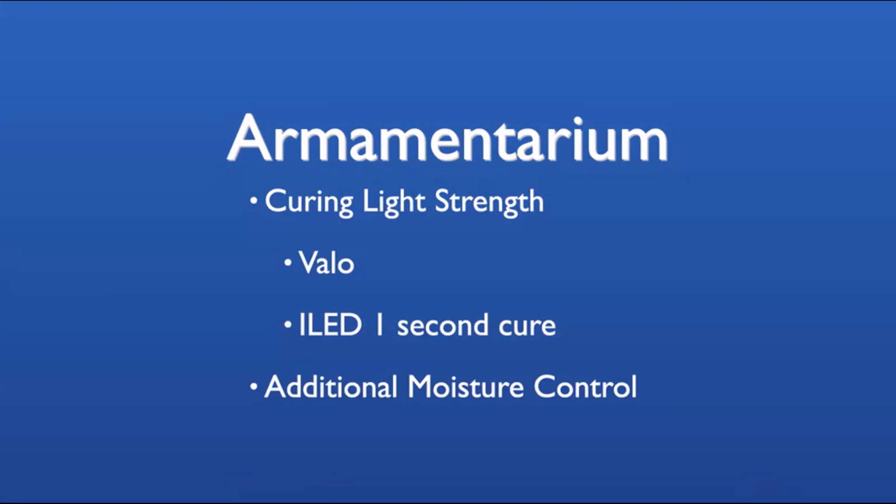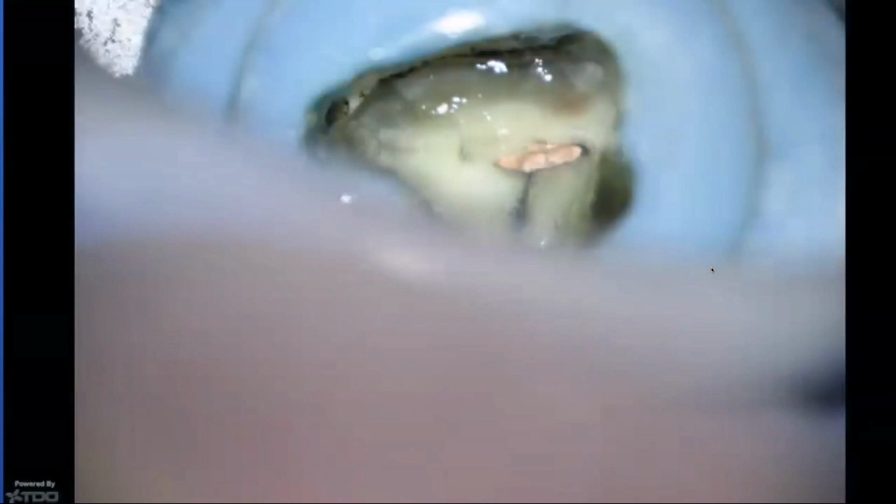In terms of additional moisture control, using something like, not opal dam, in order to seal around the rubber dam clamp, any material like Cavit that's more so hydrophilic, uh, Oraseal, Mark, or caulking. Exactly, what did you say? Oraseal? Oraseal, that's it. Thank you, thanks, Matt, I appreciate it. Using Oraseal is super helpful, especially in those areas where you're getting a little bit of seepage.